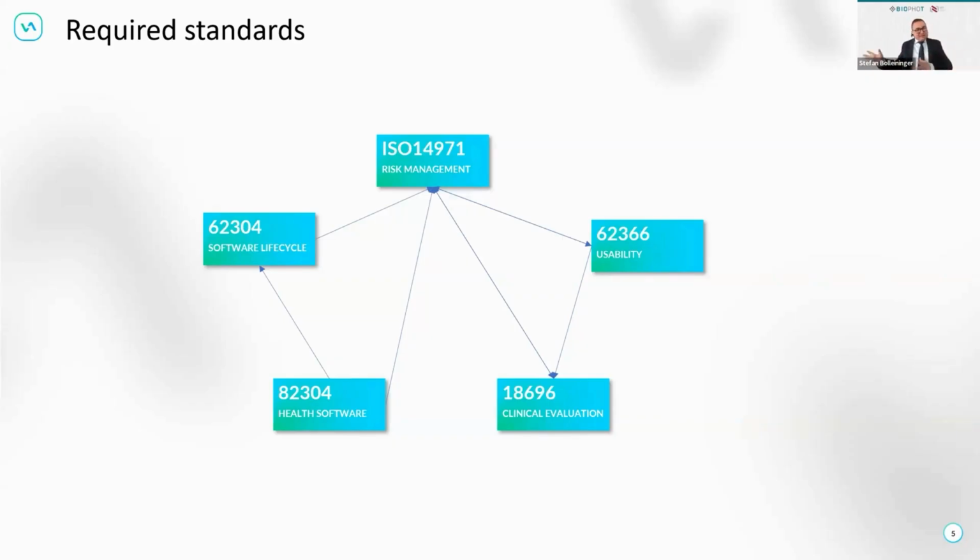So all of them can have the same outcome with, okay, patient XYZ, do more sports, eat that, sleep more, and so on. That will not create a medical device. Only if the prediction part, the curiosity insight, triggers for a certain patient risk and a certain disease, then this will be a medical device. I hope that clarifies the question. Else, please give a bit more information, then I can go more into the detail of that.